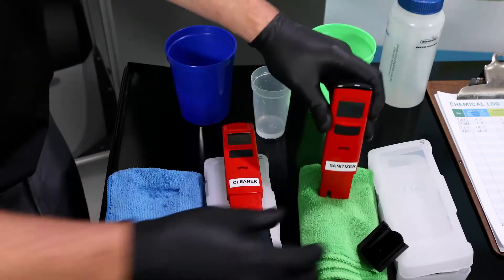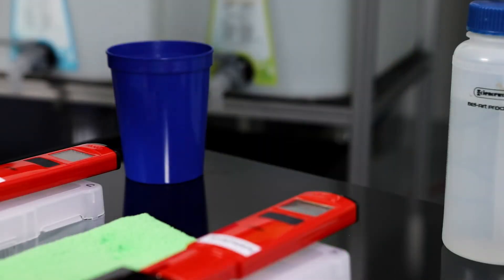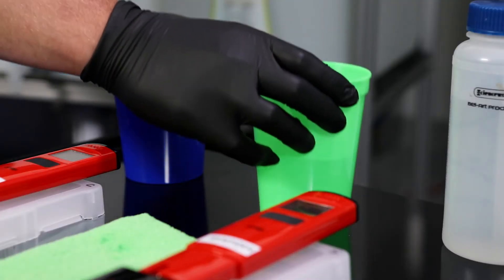These meters are ready for use in their solutions. Now fill one cup with Pathoclean and another cup with Pathosanide. Each cup should have enough fluid in it to cover the bottom of the pH probe.